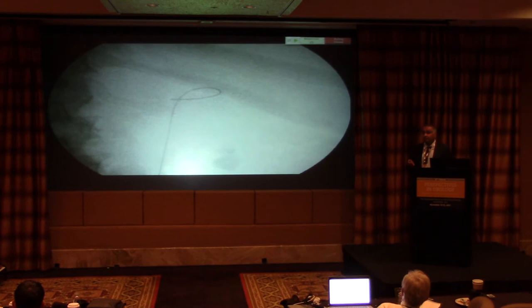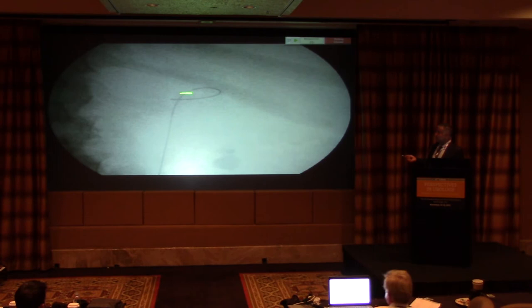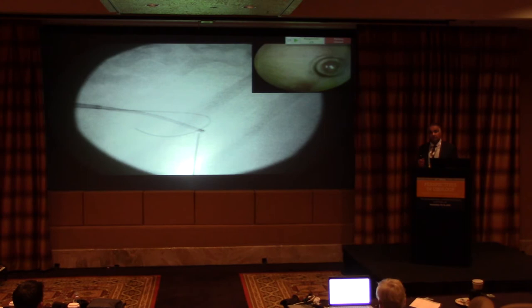So in a prone position, we're performing cystoscopy, find the UO, and place a wire up to the kidney. We then rotate the image. Rotating the image will allow you to be oriented. When you move your needle to the right, it'll move to the right. If you don't do this, then you're working 90 degrees off from yourself, and you're doing a lot of this motion to try to figure out where is that needle. So placing the spine on top allows you to be oriented in terms of your needle motion.